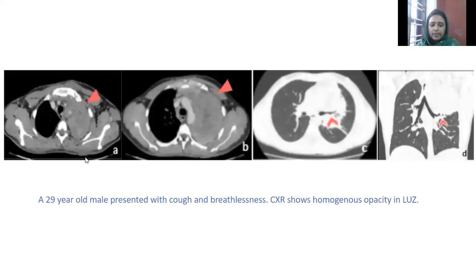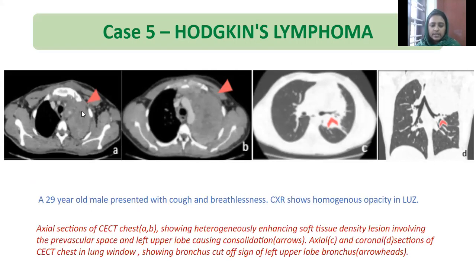A 29-year-old male presented with cough and breathlessness. Chest X-ray showed homogeneous opacity in the left upper zone. Axial CT chest images showing heterogeneously enhancing soft tissue density lesion involving the pre-vascular space as well as the left upper lobe, causing consolidation. Axial and coronal sections of CT chest in lung window showing bronchus cut-off sign in the left upper lobe bronchus. Biopsy revealed Hodgkin's lymphoma.